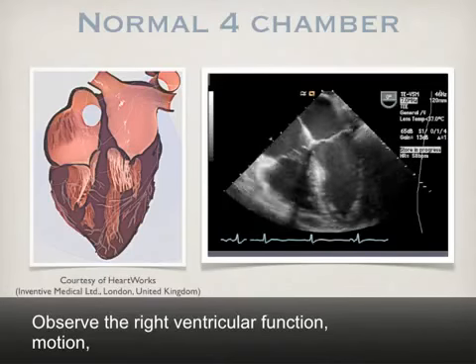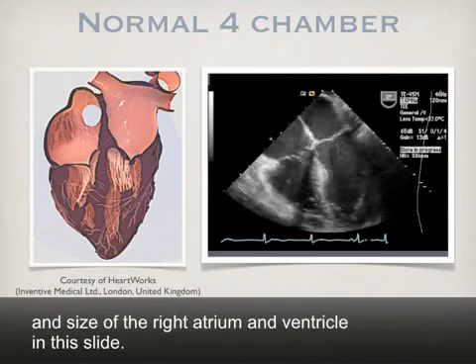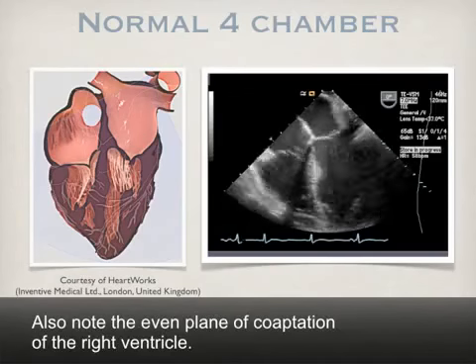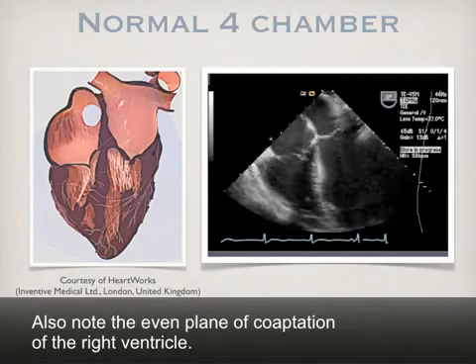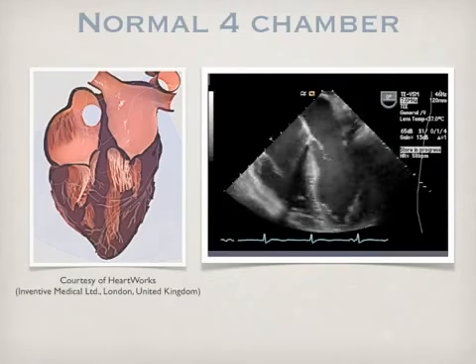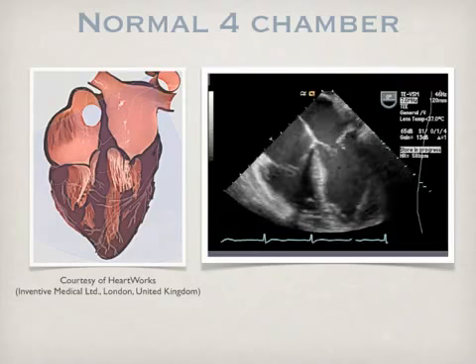Observe the right ventricular function, motion, and size of the right atrium and ventricle in this slide. Also note the even plane of coaptation of the right ventricle. This represents normal right ventricular structure and function.